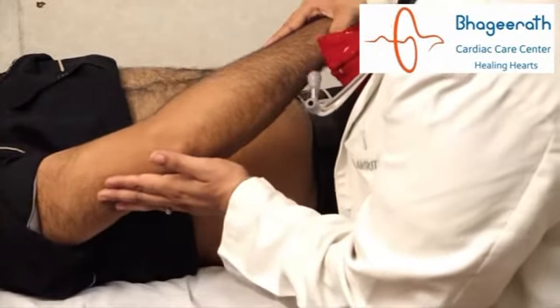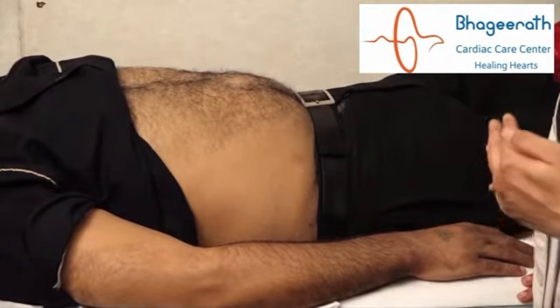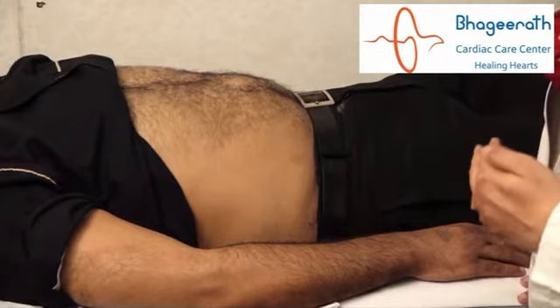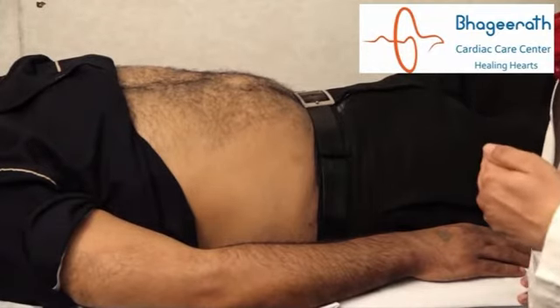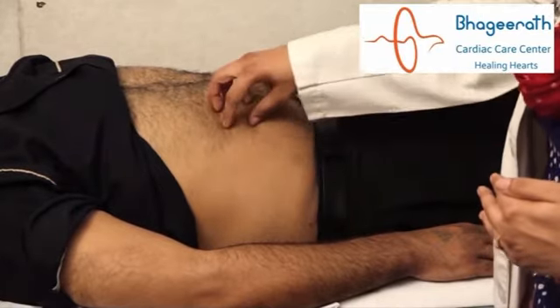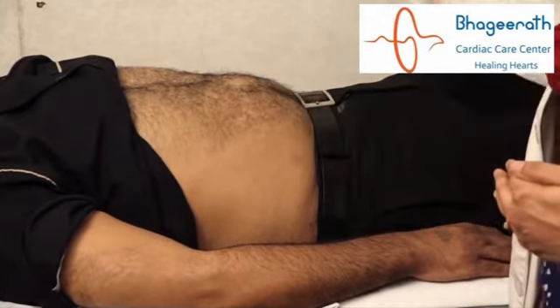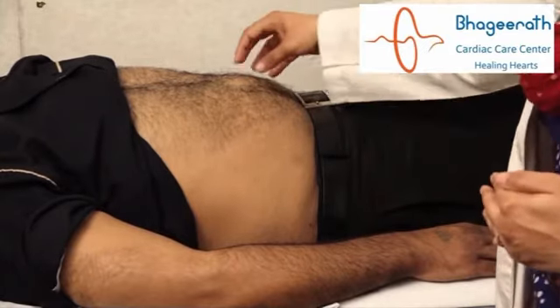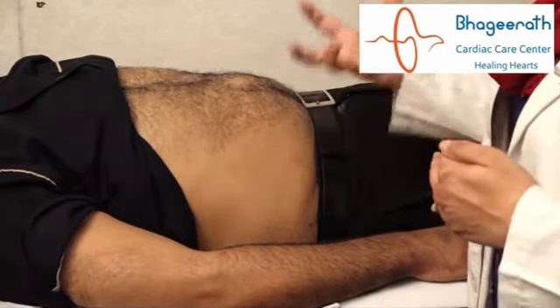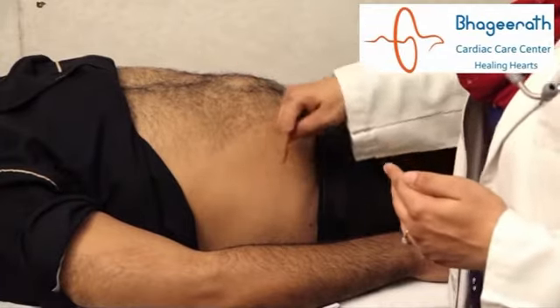Why is rotation important in a patient? Because not rotating can cause lipodystrophy, that is the abnormal distribution of the fat. Lipodystrophy can be of 2 types. It can be lipohypertrophy, that means you will see some swelling around the area where the patient is injecting again and again, or lipoatrophy, that means you can see some absence of the fat from a certain area. Both can cause some variation in the insulin absorption. That's why the patient should always be instructed to rotate the site whenever they inject.